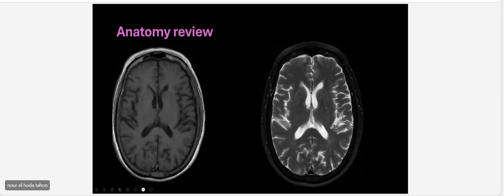And the septum pellucidum is here. Looks good. I'm talking about children, kid patients. Sometimes you can see an absent septum pellucidum if they have some congenital anomalies or something. And here again, this is the frontal lobe, and you can see part of the sylvian fissure here. We call this the frontal operculum and temporal operculum, the lobes that surround the sylvian fissure.